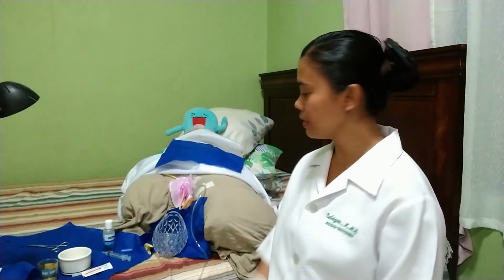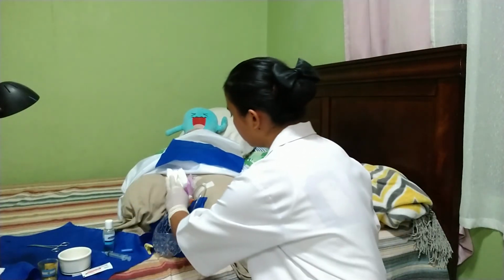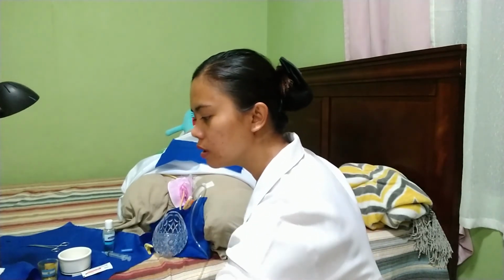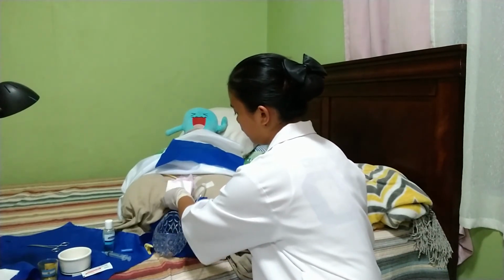The next thing to do is to cleanse our patient's perineal area as needed and dry it. We have to remove the antiseptic solution that's left in here because it can cause irritation to our patient. And dry it to avoid skin irritation as well.